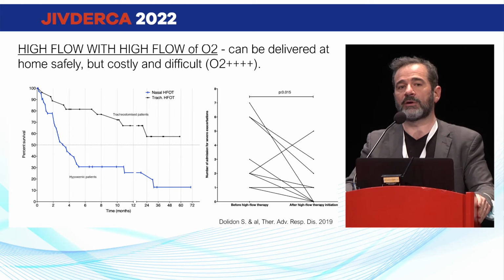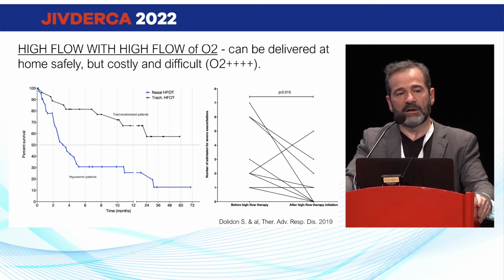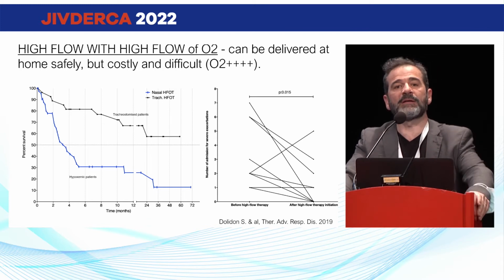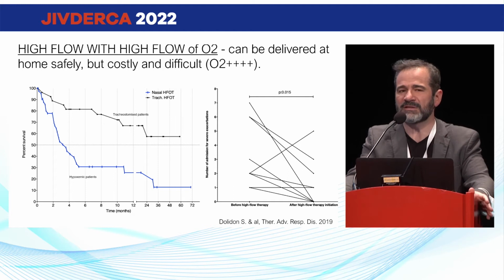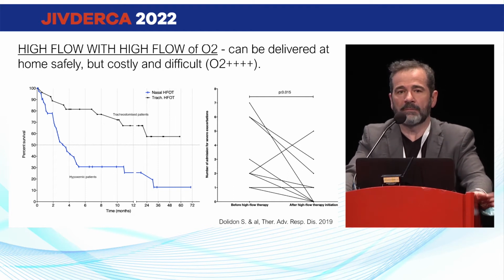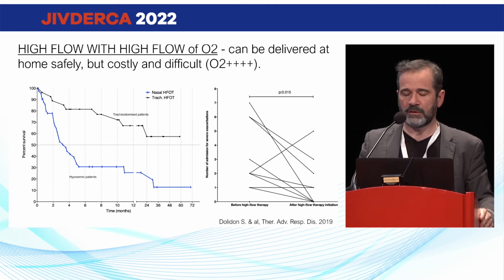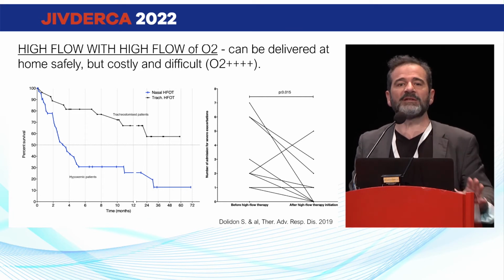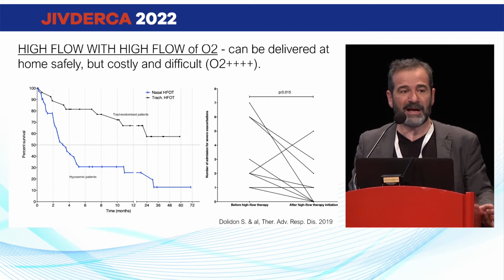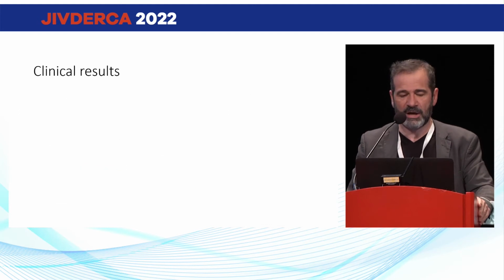And then if we go to the clinical studies, yes, Maxime Patou and colleagues did it at home as Annalisa Carlucci show, with high flow and high oxygen. But if you ask him, how was it? Was it easy? It was horrible, because patients had to have 2 tanks of oxygen at home. You see in the results of Annalisa that the flow of oxygen was around 20 liters per minute at home. So you must imagine how many times you must change the tanks.